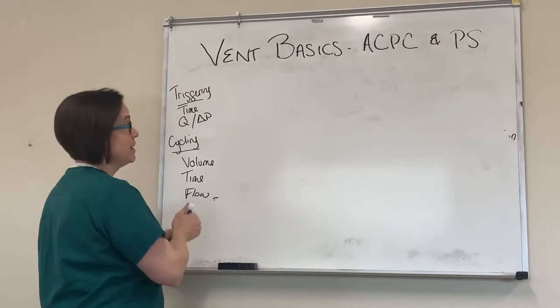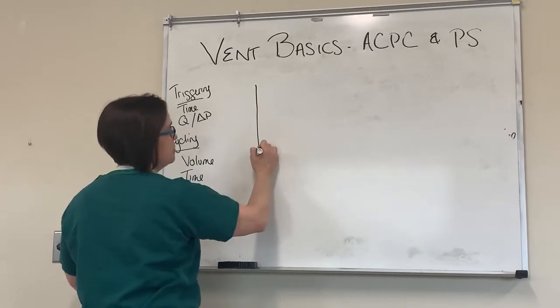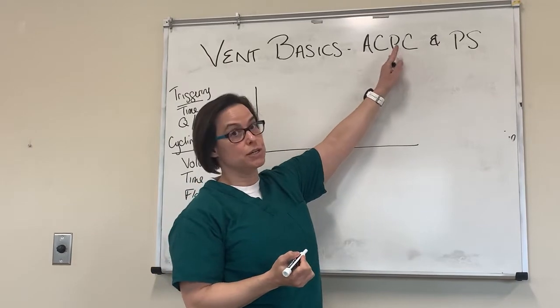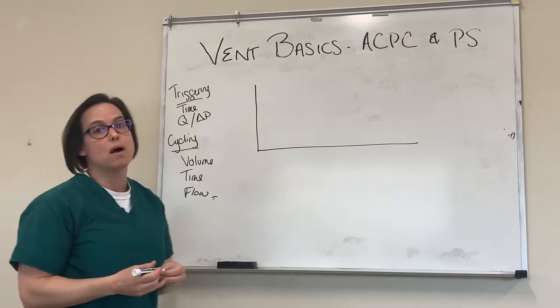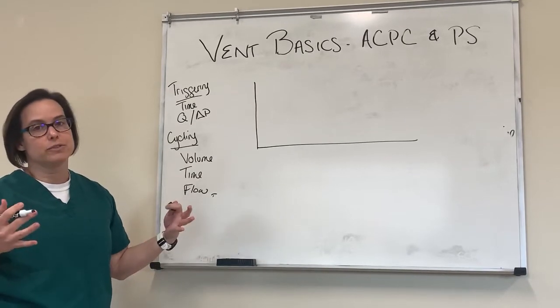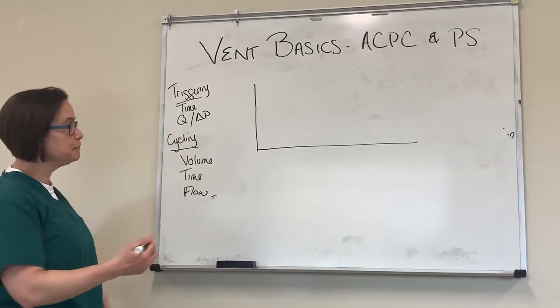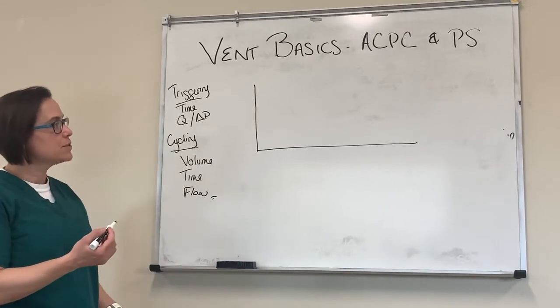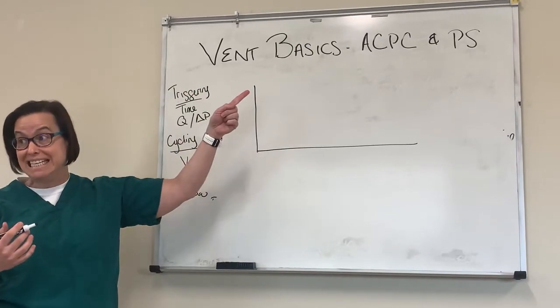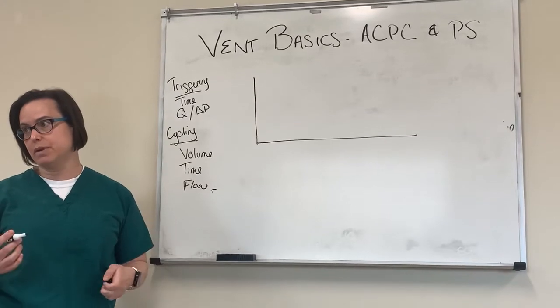We're gonna talk about ACPC. Assist control pressure control. Some ventilators call it pressure assist control. It's all the same thing. There's several different names for it on different ventilators. All right, so Brooke, if I was gonna order ACPC, what do I need to tell the respiratory therapist?